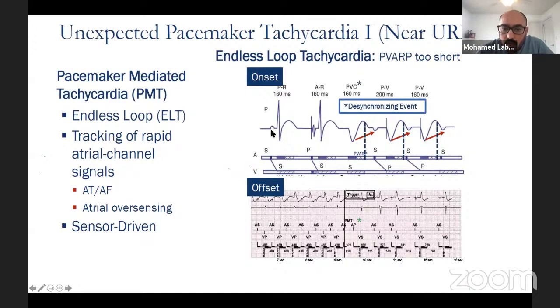Okay, so now you have a dual chamber pacemaker. The patient is having sinus beat, no problem, sensing that. You sense the A, and the P goes down to the QRS, you sense V. So this is normal, so far so good. Now you waited for whatever interval that you're waiting for, AA interval, and A is not coming, or P is not coming. You pace in the A, you conduct it down to the V, you sensed V, you didn't pace in the V.